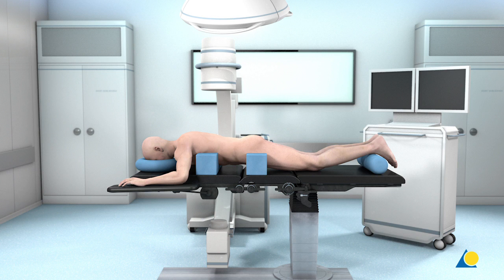Once the patient is positioned, the affected vertebrae are checked with the image intensifier to ensure they are seen clearly in both AP and lateral planes.